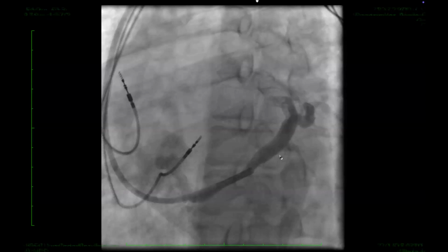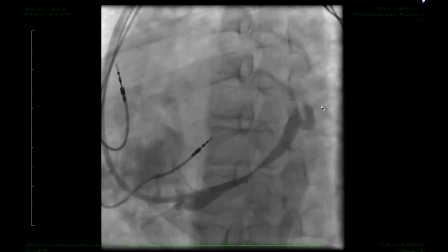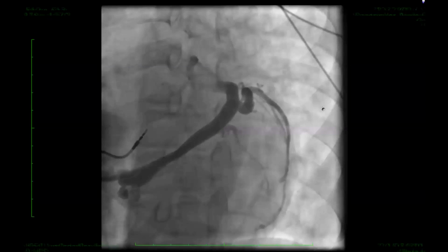They're usually in the lateral or posterolateral position, as Dr. Hasham's very clearly emphasized. And what I'm going to now do is show you the same image, but now in a PA position. PA is easier to work in. So you've got two branches there. You've got this relatively small branch and this very big branch. I'm going to ask Hasham which of these two branches he would aim for.